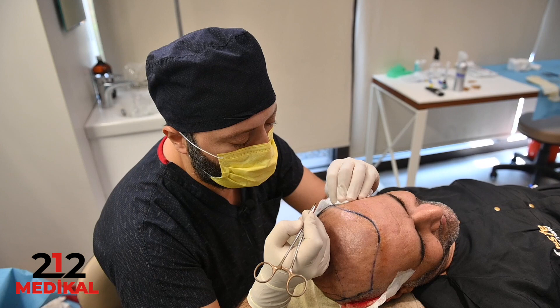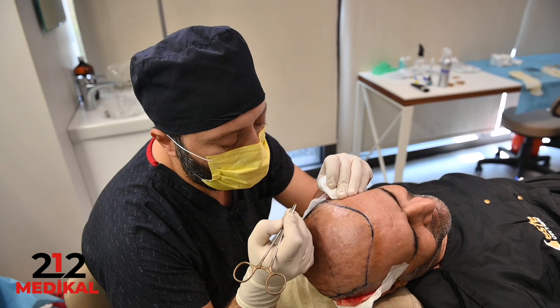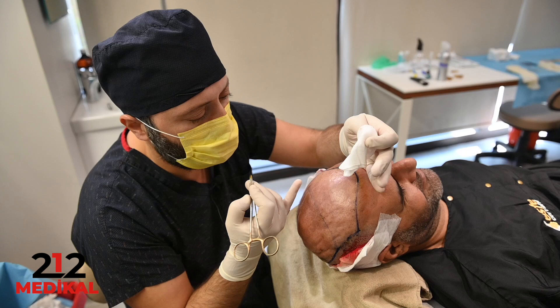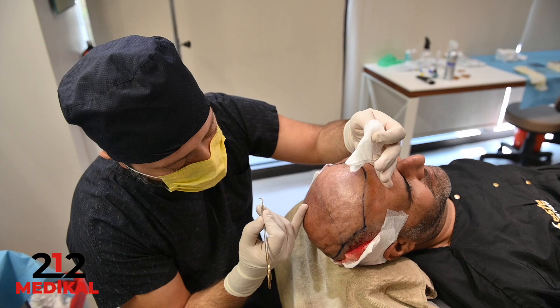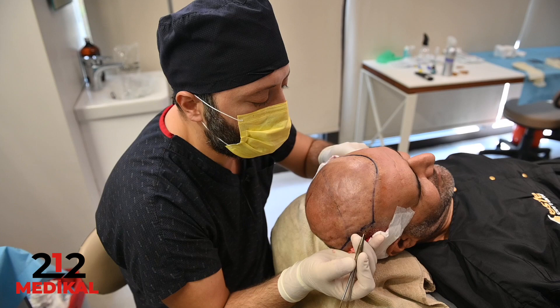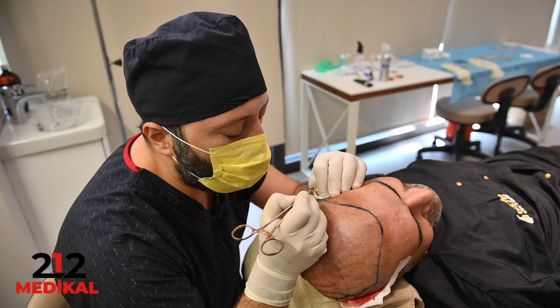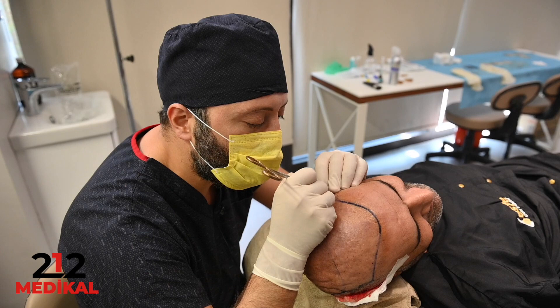During the micro FUE hair implantation procedure, we first finish extraction and sort the grafts. We extract around 3,000 grafts in the first step. If the patient's balding area is large, we divide the operation into two sessions — covering the front region with 3,000 grafts first, then the top and back region the next day with another 3,000. We open the holes using the lateral slit technique, using single-follicle grafts in the front region to achieve maximum density with the natural direction of the hair.